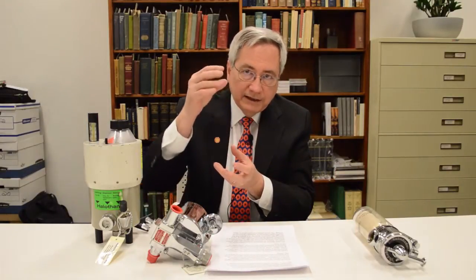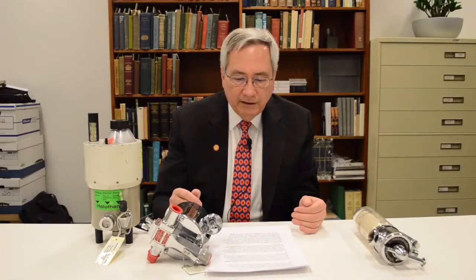Anesthetic vaporizers are devices that are used to convert a quantity of liquid anesthetic into anesthetic vapor, and this vapor is then blended with some combination of oxygen and/or nitrous oxide and air to be delivered to the patient where it's inhaled and then becomes part of that anesthetic for that patient. Control of the concentration of the inhaled anesthetic agent then is an important factor in administering a safe and effective inhaled anesthetic. The importance of the control of the concentration of inhaled anesthetic agent increased as halothane was introduced into anesthetic practice in the 1950s.